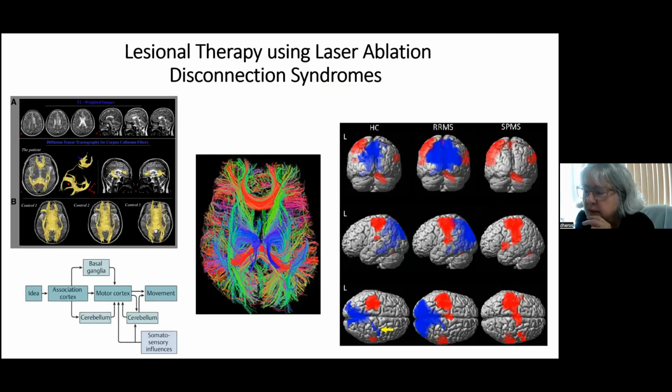We're now ablating large tumors in the corpus callosum, the splenium, and deep white matter structures, so flash those images in your mind when you're deciding whether or not to perform an ablation procedure. And I think it's very important that we start to monitor the outcome of these ablative procedures by doing neuropsychometric testing.